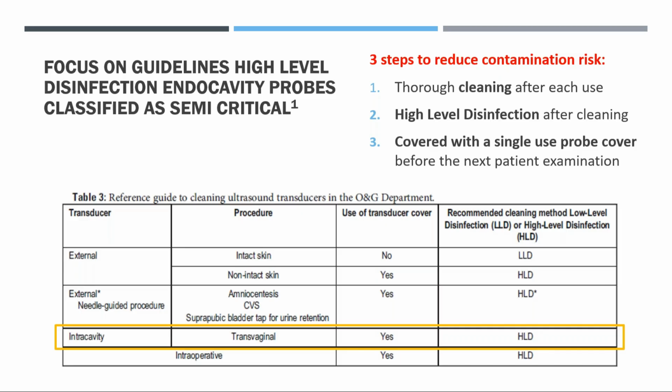For external probes, if it's intact skin, you really don't need a transducer cover, but it's always good and safe to use one and low-level disinfection. If you're using the probe on non-intact skin, such as a burn patient, you should be using a transducer cover and high-level disinfection. If you're using amniocentesis or suprapubic bladder tap, again, you can use a transducer cover and high-level disinfection.